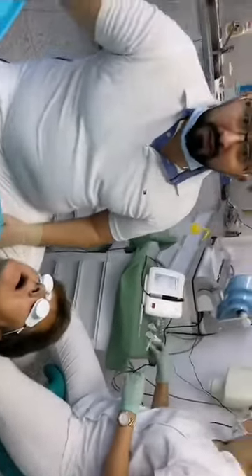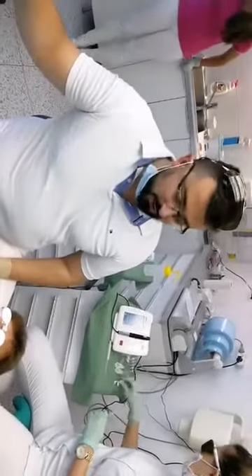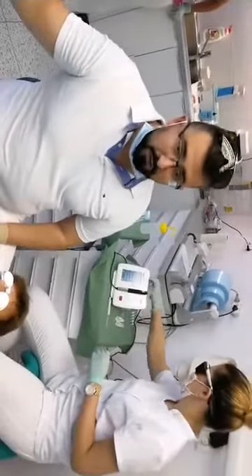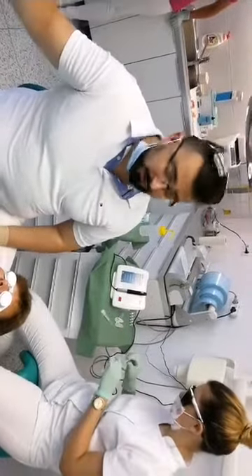Hello, welcome. Today you will see the live surgery. We are going to do the lower total frenolectomy and vestibuloplasty, and upper medial and lateral frenolectomy.